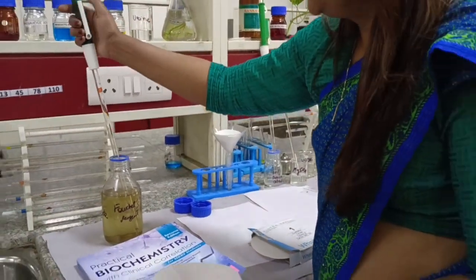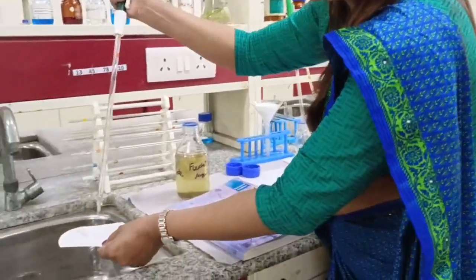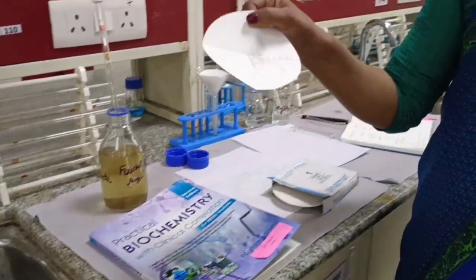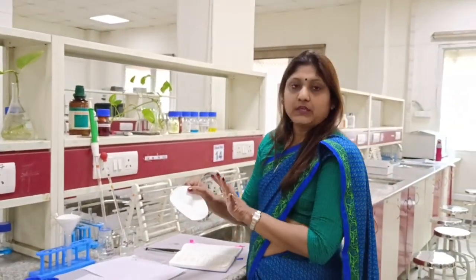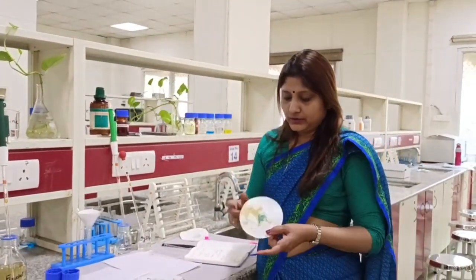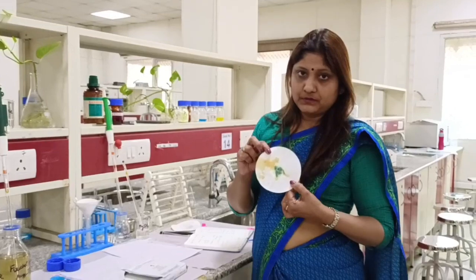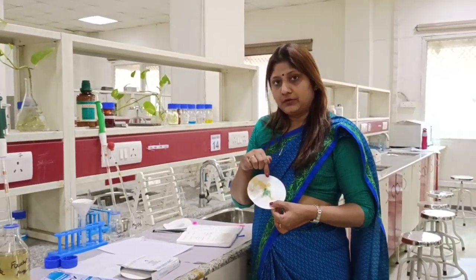Now add just two drops of Fouchet's reagent onto the precipitate on the filter paper — do not use too much. Then place the filter paper again in the hot air oven for 5 minutes at 50°C. After drying, observe whether any color change has occurred. You will see a leafy green color on the filter paper. Presence of this leafy green color on the filter paper denotes that bilirubin was present in the urine.